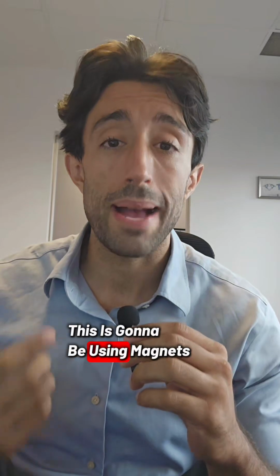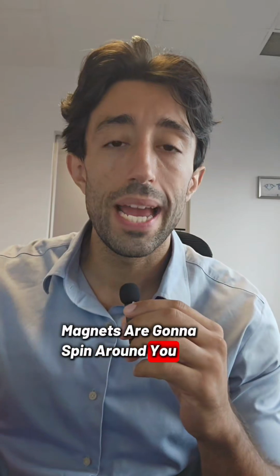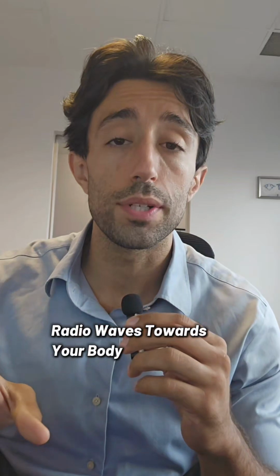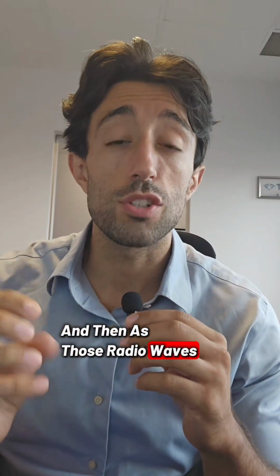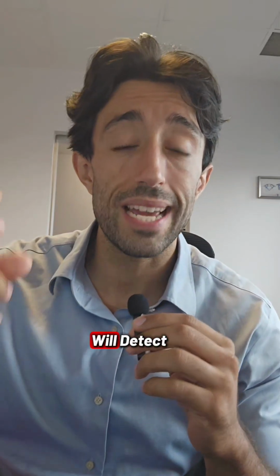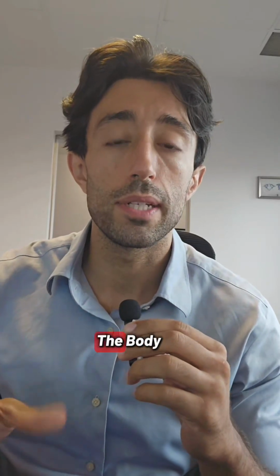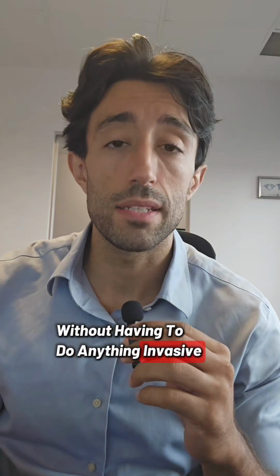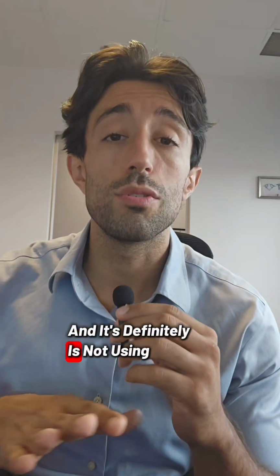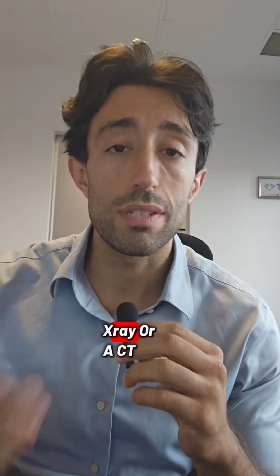This is going to be using magnets. So essentially, at a very simple level, the magnets are going to spin around you. And as they're spinning around, they're sending bits of information, radio waves, towards your body. And then as those radio waves stop, your body is going to be sending off information that the machine will detect. And the detection is what tells you where different parts are in the body without having to do anything invasive. So even though it is using magnets, this is not invasive, and it's definitely not using any ionizing radiation like we would see in an X-ray or a CT scan.